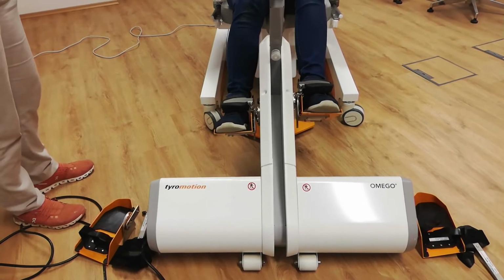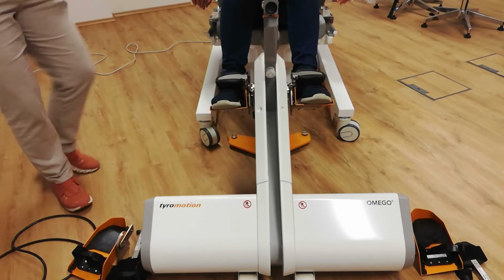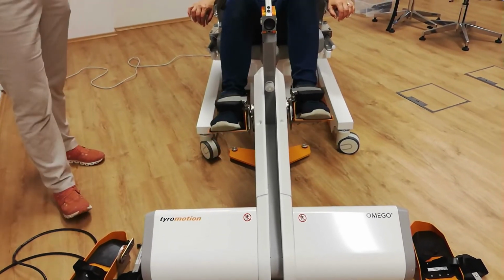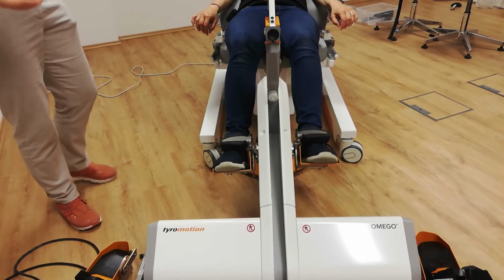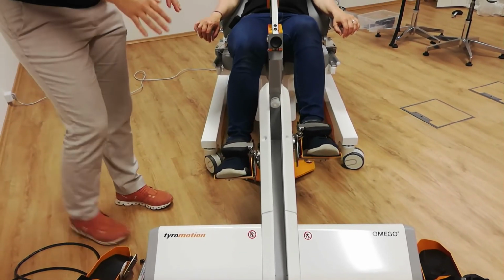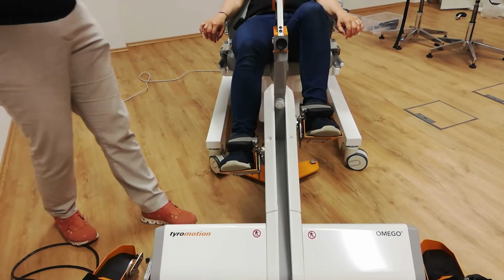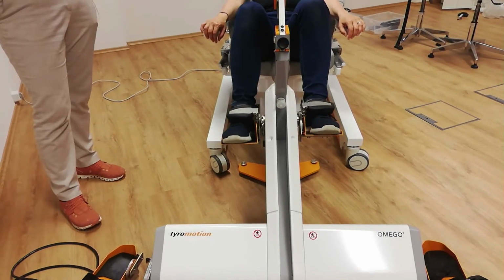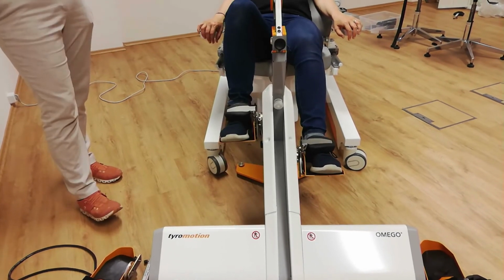Here you can see that if she presses more with one side, the left leg will not follow anymore. Before that, even if she pressed with one side, the other leg would follow. Now they are decoupled, so she has to apply the same amount of force on the left and on the right side to continue this exercise.